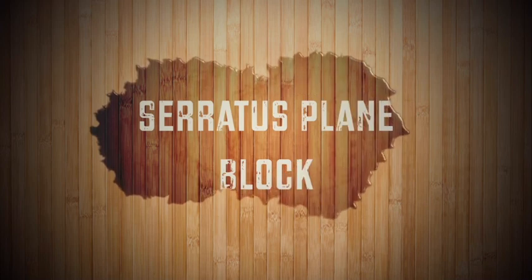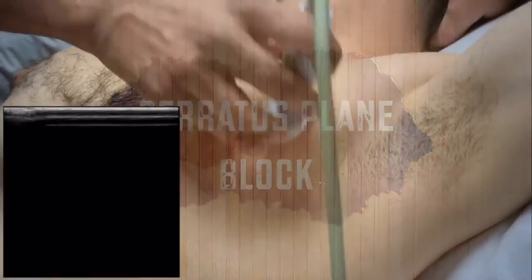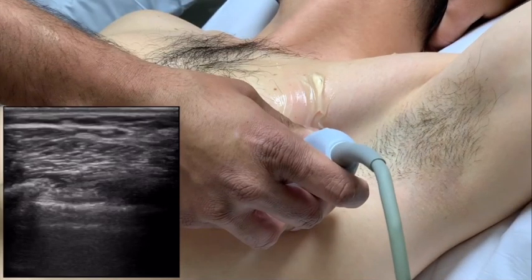Alright, so let's talk about the serratus now. I generally like to do the serratus with the arm up, and you're scanning first to look for the ribs. Typically you're looking for the fourth rib, and you want to see it in cross section. Now some people will do the injection in plane, and I find this to be a little bit difficult. I often do my injections out of plane so that you can travel a shorter distance with the needle right to the plane that you're interested in.